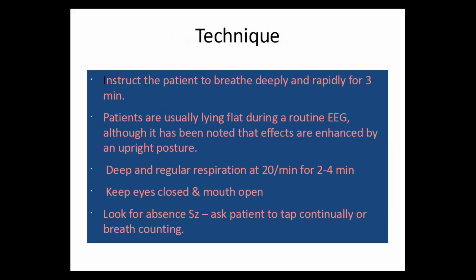So you instruct the patient to breathe deeply and rapidly with the mouth open for 3 minutes. Patients are usually lying flat during routine EEG. But if you are doing the test with the patient in an upright posture, you will get a better response, because the patient will be able to do deep hyperventilation in the sitting posture than the lying posture. So, deep and regular respiration at 20 per minute for 2 to 4 minutes.